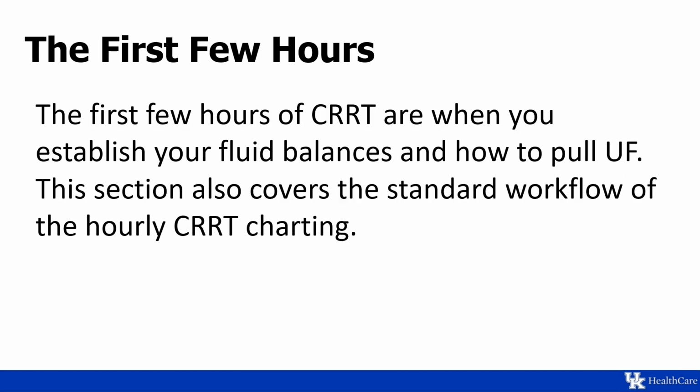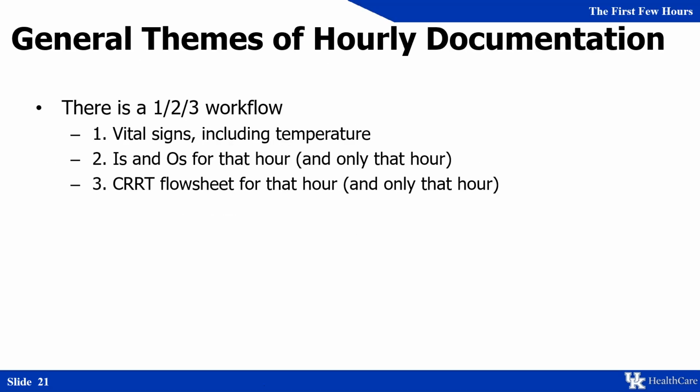So let's go through the first few hours of CRRT and show how to pull fluid on 3 different UF prescriptions: net negative, even, and 0. We're going to cover the standard workflow of the hourly charting. There are general themes of hourly documentation. First of all, it's a 1, 2, 3 workflow.